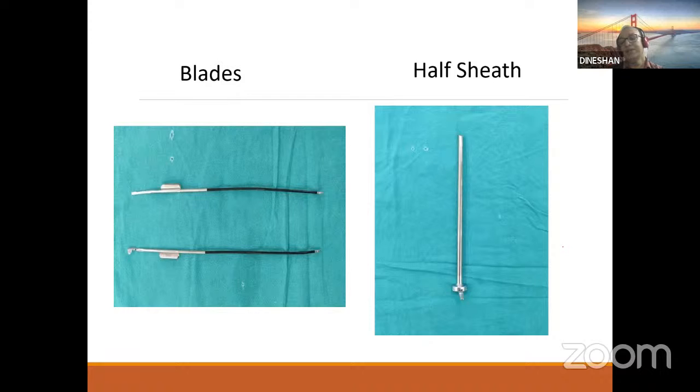Posteriorly, the spongiosa is very thin, so you can get extravasation also. Technically, posterior cutting is also difficult, so it should always be done at 12 o'clock.